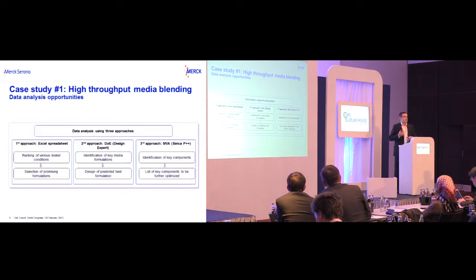With tools such as the Design Expert software, we can really analyze our data and identify the key medium formulations out of the 16, but also make predictions, to see if I need 1, 2, 3 media formulations and what proportion of each one.